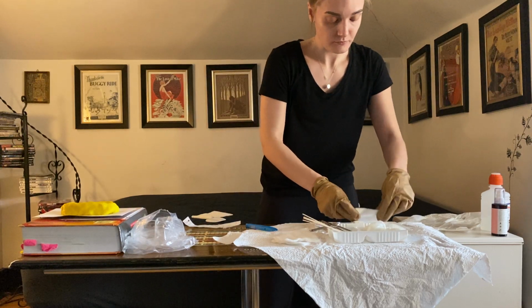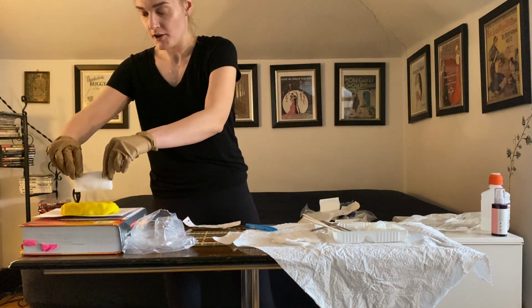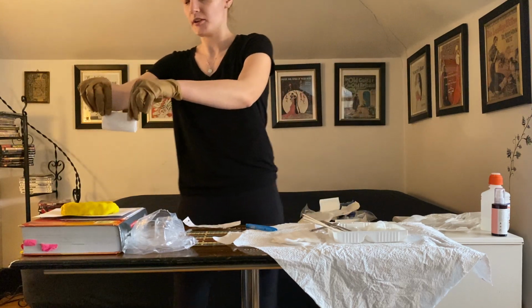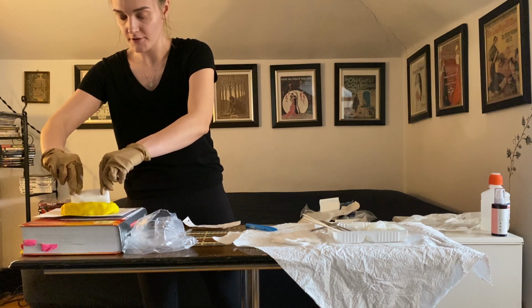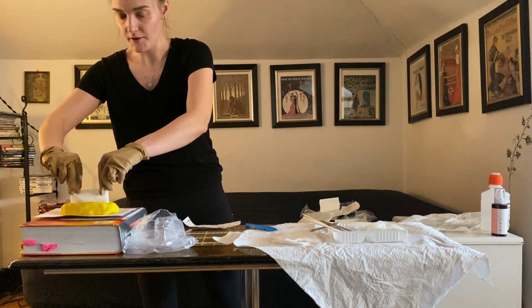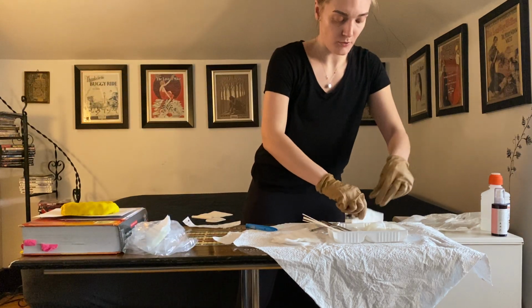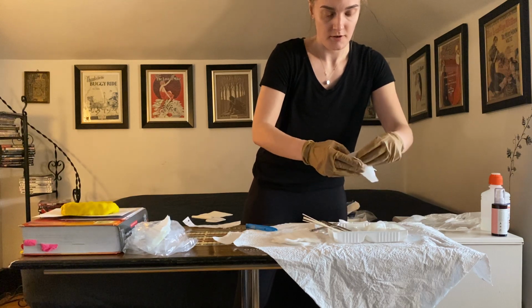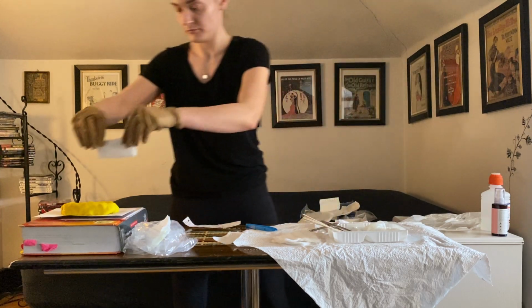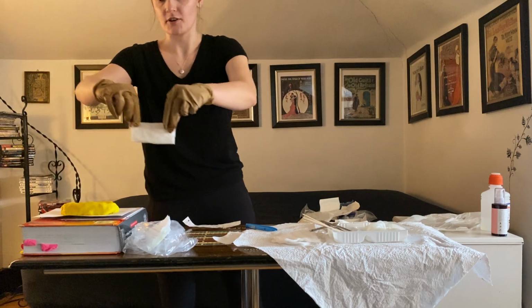So using 2 4x4s, or just one, I don't want to let it touch the tips of my gloves here, so I'm only going to drop it in, and I just want to be mindful that it's not soaking all the way up to my gloves. So then I'm disposing of that. And I'm going to use one more just because there is still a bit of water in there, or the normal saline. It should be about as moist as an eyeball. So again, making sure that it's not touching the gloves.